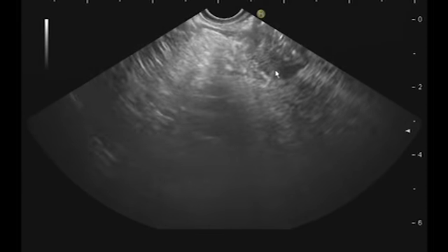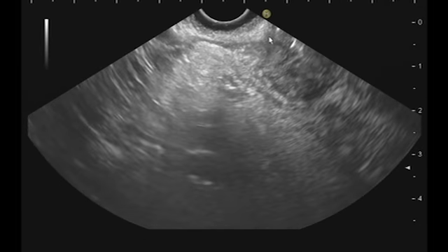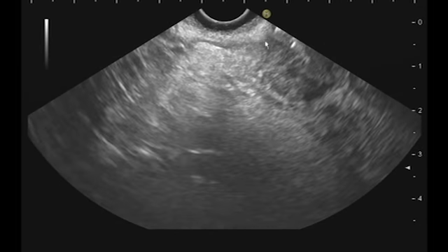Okay, and here you see the lesion. Here, I increase it a little bit. And you see that this lesion is not limited to the duodenal wall. Here you see the muscularis of the duodenal wall, and this muscularis disappears here. And this is the lesion. And this lesion is an invasive carcinoma. And there is no indication for an ampullary resection, but this patient should be a candidate for surgery.